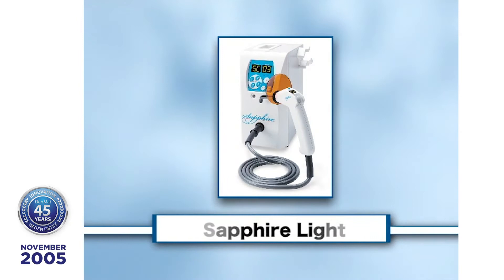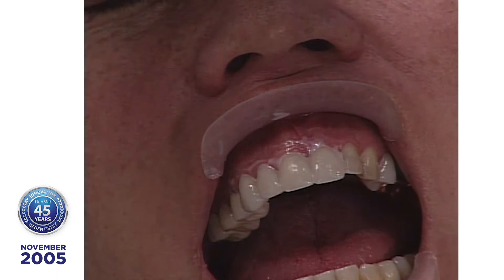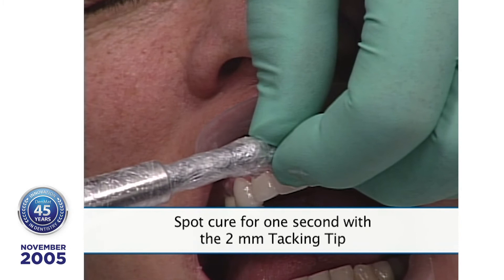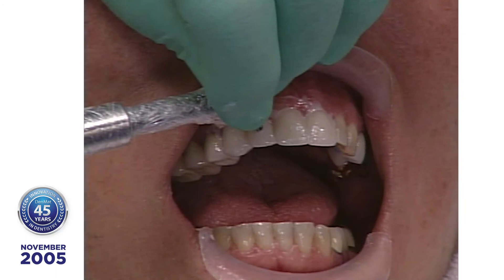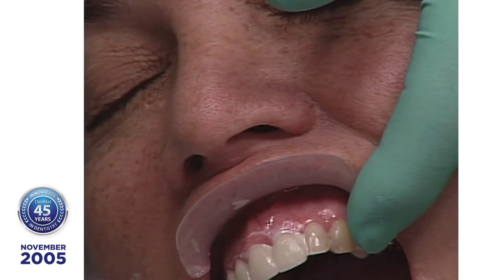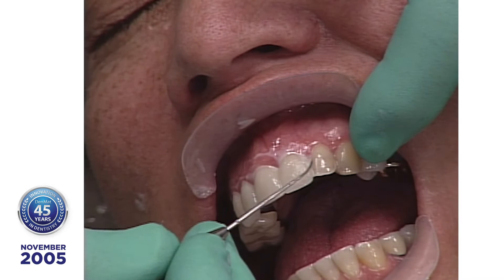I'm going to spot cure the center of these teeth so when I shift to the other side, they won't dislodge. Many dentists have had a problem trying to finish before the resin was set. Give it one second on the two-millimeter tip — close your eyes. Now on the left central, I didn't give it the one-second spot because I don't want to risk setting this resin. The resin is so soft on the interproximal — this ensures I'm going to get a perfect fit as I put these together and all contacts will be perfect.